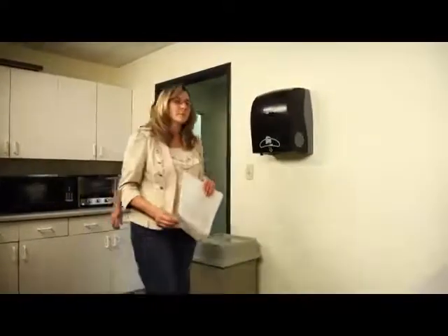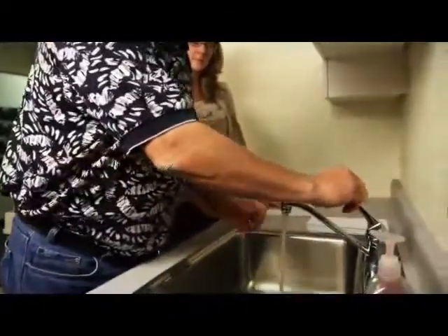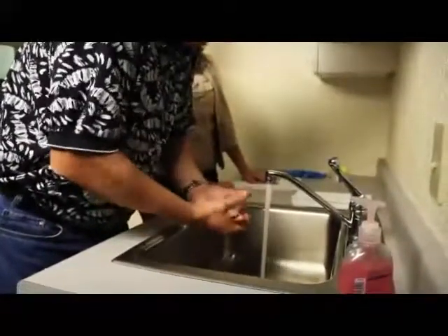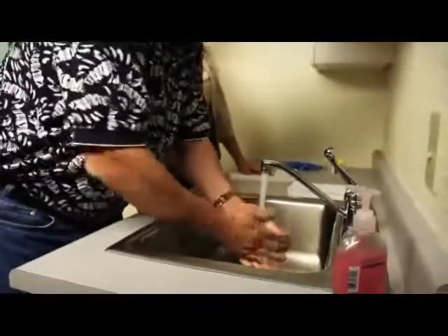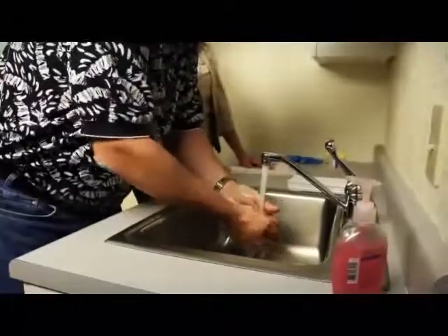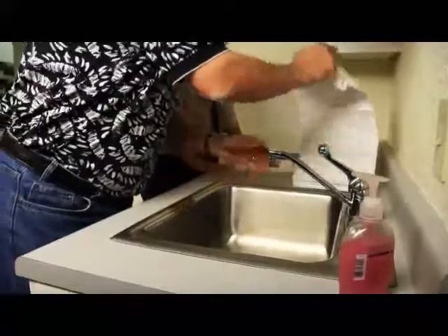Instruct the donor to wash and dry their hands under your observation and inform the donor not to wash his or her hands again until after the specimen is provided. The donor may use soap, and if practicable, it should be a liquid or a cream. A solid bar of soap gives the donor the chance to conceal soap shavings under his or her fingernails and use them to attempt to adulterate the specimen.